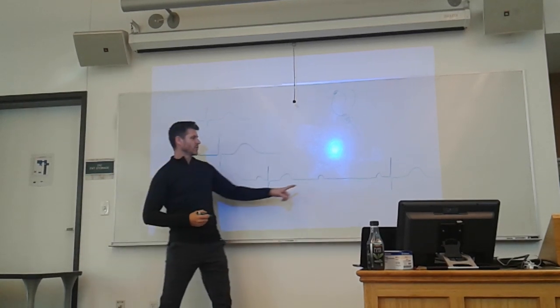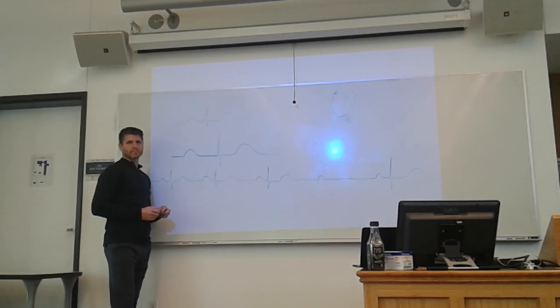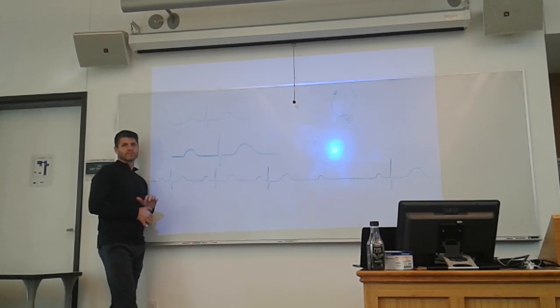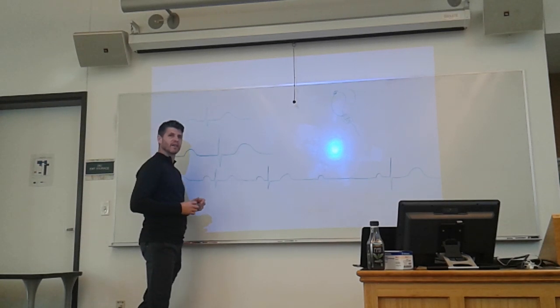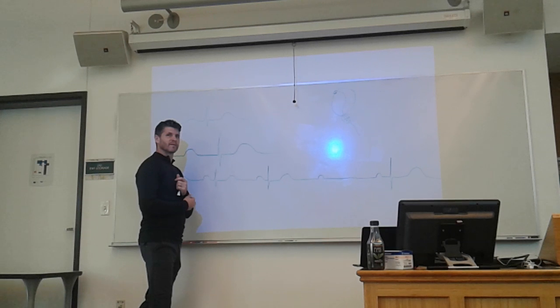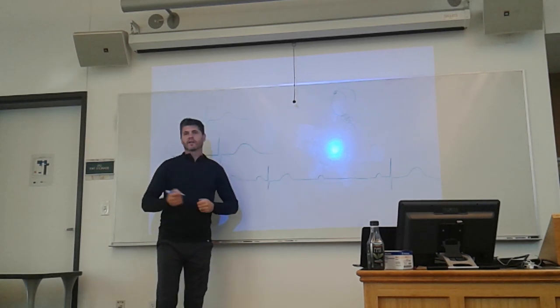It's possible though that you will see a little bit of a wave there that is the Ta wave. Would that be positive or negative deflection? In which lead, first of all? It would be negative. Why would it be negative? The only reason that the T wave is positive in lead two is because it repolarizes out in, but that wouldn't happen in the atria, because they repolarize in the same way they depolarize. Good.